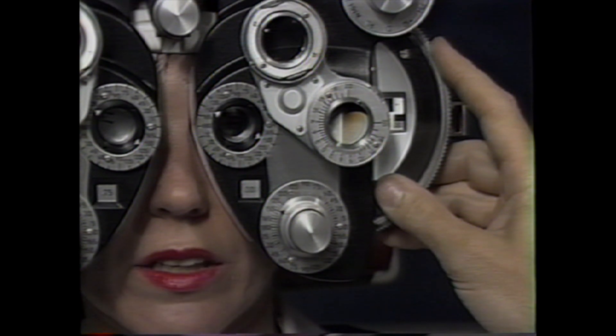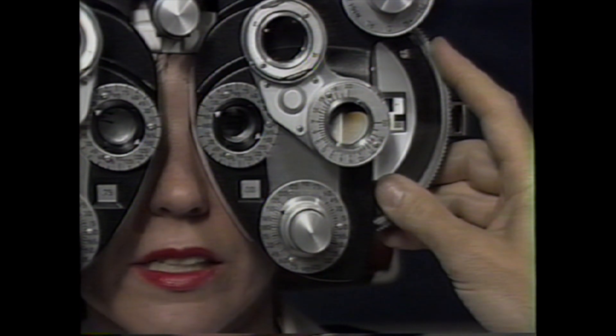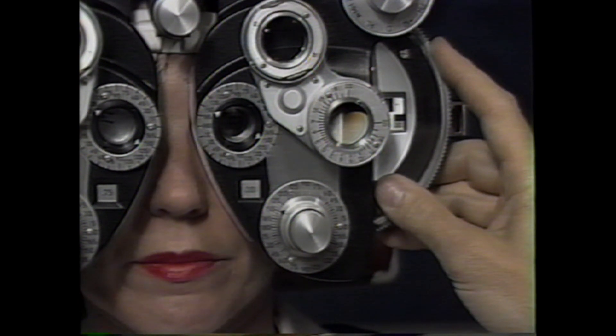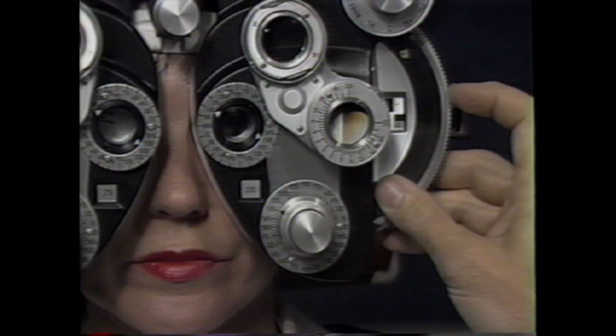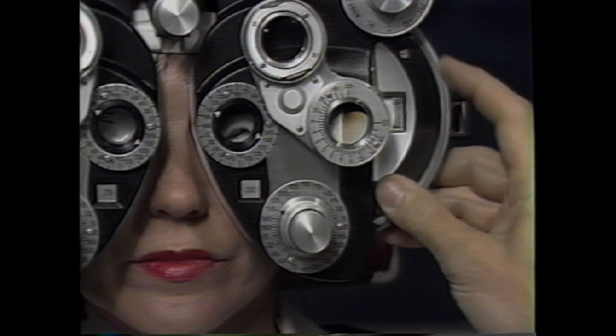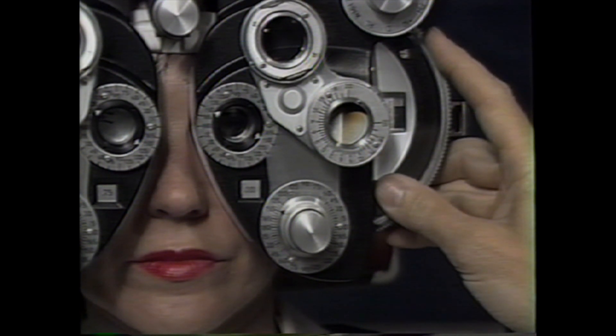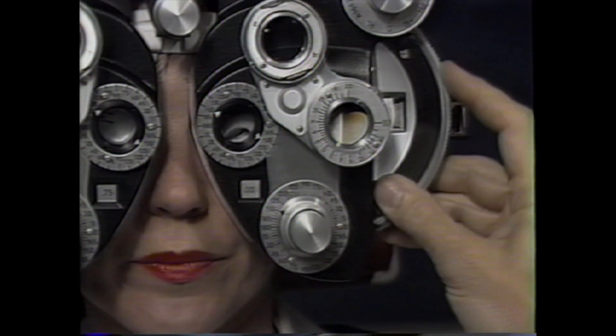How far can you read now? T-Z-V-E-C-L. One more time. Better or just smaller and darker? Ready? There. Just smaller and darker. Good.